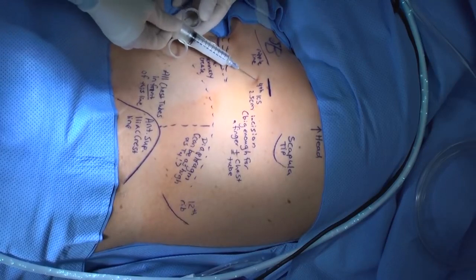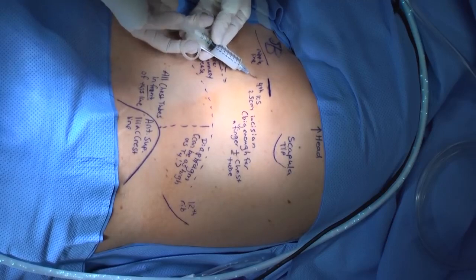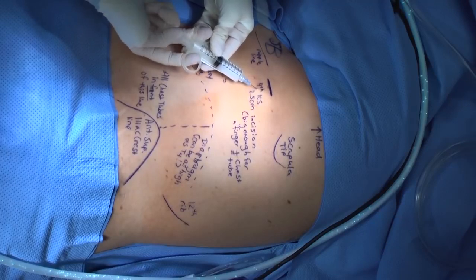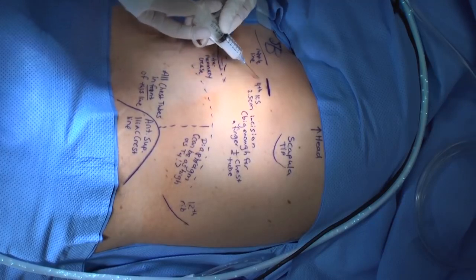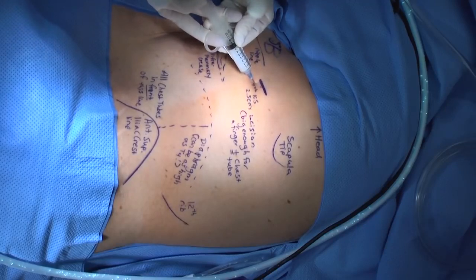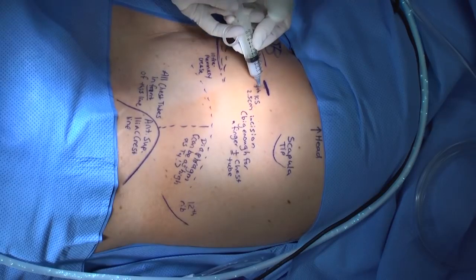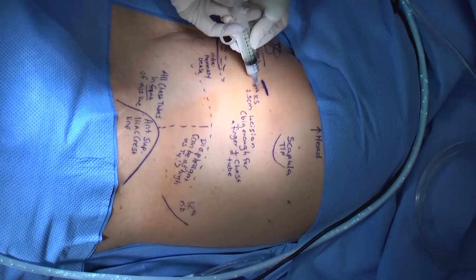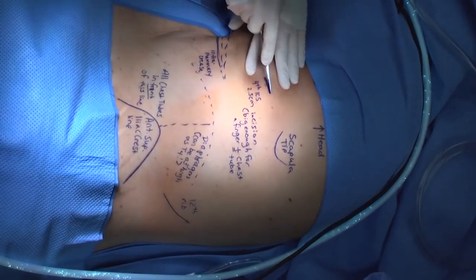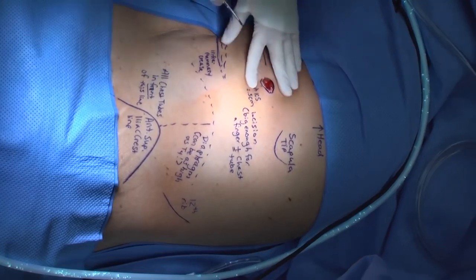For patients who are intubated and asleep, you have the benefit of general anesthesia. For awake patients on the floor, chest tube insertion can be performed in a comfortable manner without the use of sedation if local is performed properly. Skin must be anesthetized and allow adequate time for the medication to take effect. As dissection is carried down to the chest wall, each layer should be anesthetized, followed by the pleura again, allowing time after each step for the local to take effect. Have all 30 mLs drawn up ahead of time and ready to use. In particularly deep patients, a Kelly clamp can be used to help identify the path the needle needs to follow.